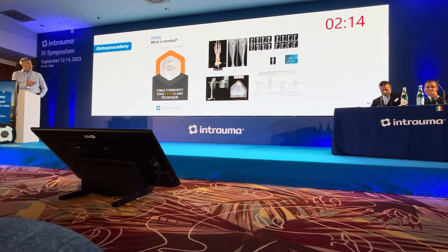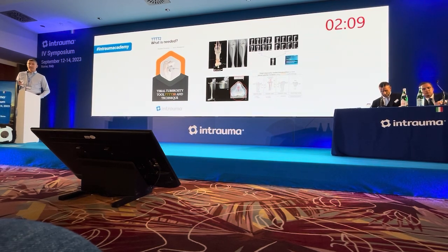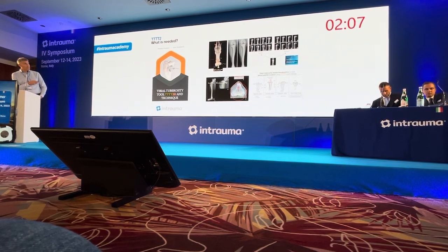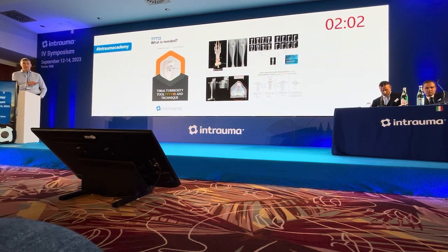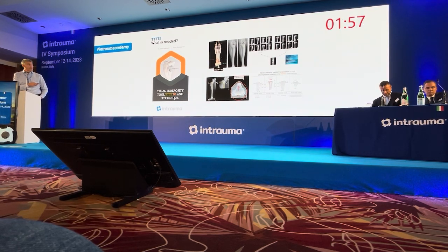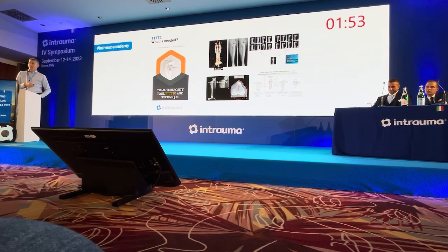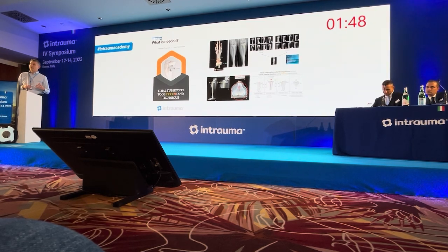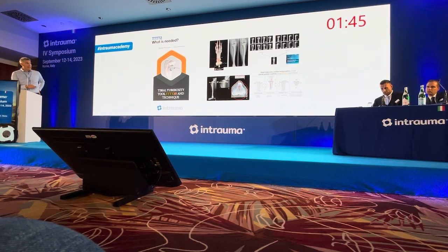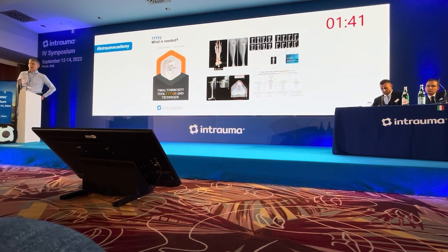But to begin with, it's important to, again, accurately assess and plan for deformities, and that begins either with a well-described CT technique or estimation from tibial radiographs to estimate the degree of torsion. And then what's new, and you'll find in the book, is a geometric and trigonometric method to plan the amount of translation required. And again, the new tool follows the same principles as the original.